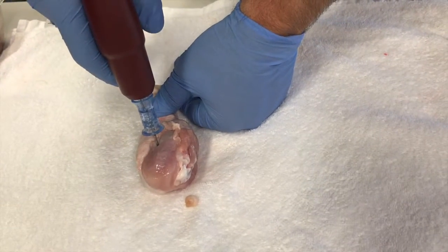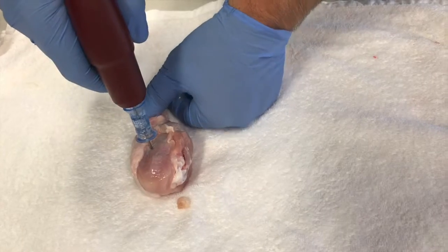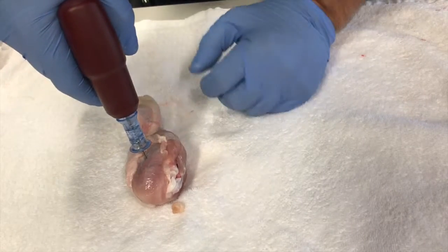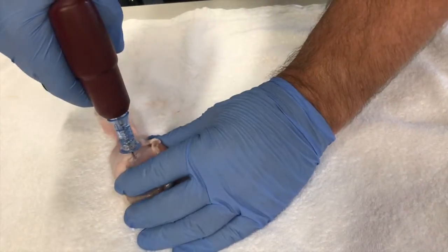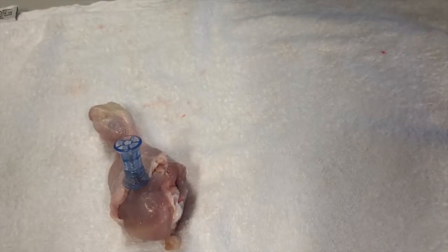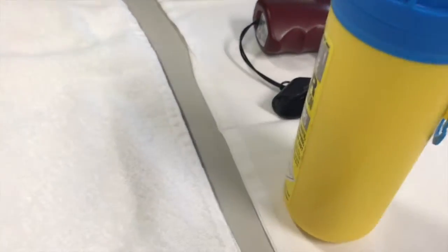I push the needle through the skin until I hit the bone at 90 degrees to the bone. I make sure that I've got 5 mm of the needle at least above the level of the skin, or at least 1 black line, and if I haven't, I go up in size on the needle. I pinch the skin and I drill until I feel a loss of resistance to insertion, removing my drill. Unscrew the needle, calling sharps out and placing it in the sharps container.